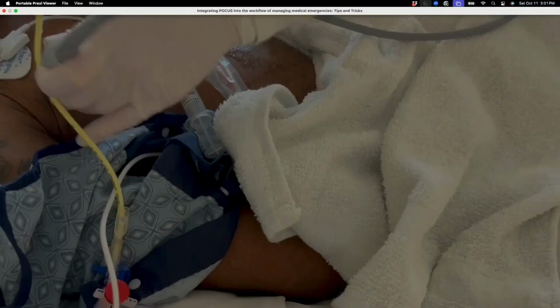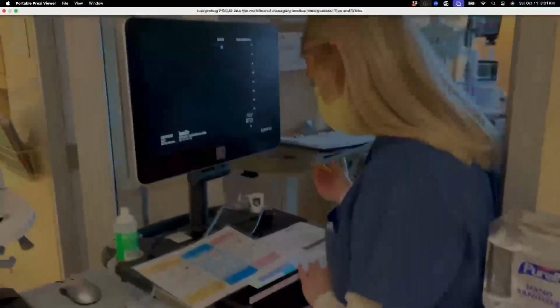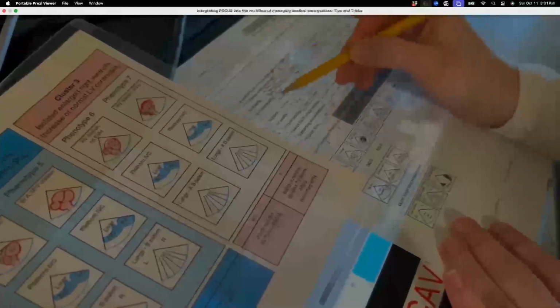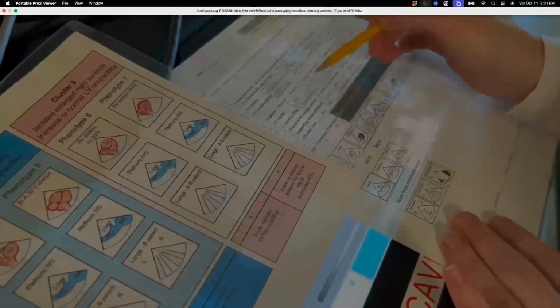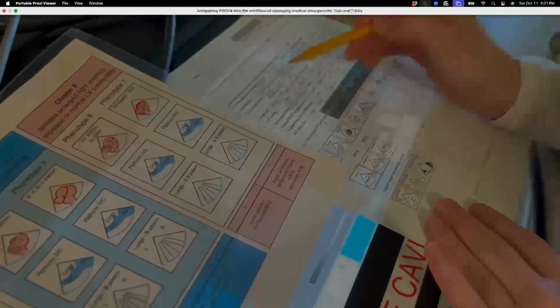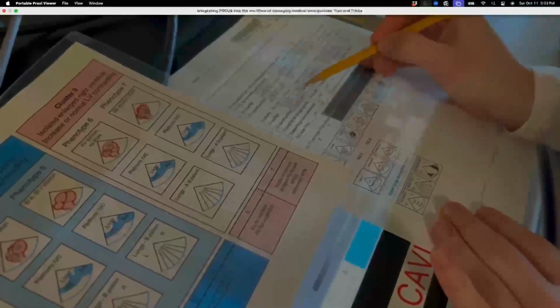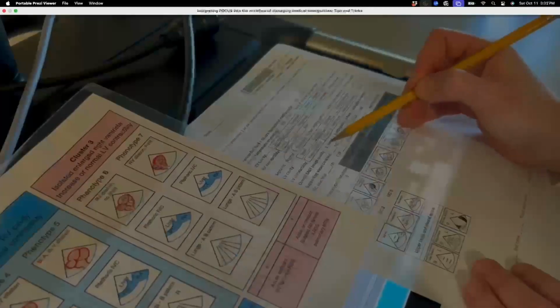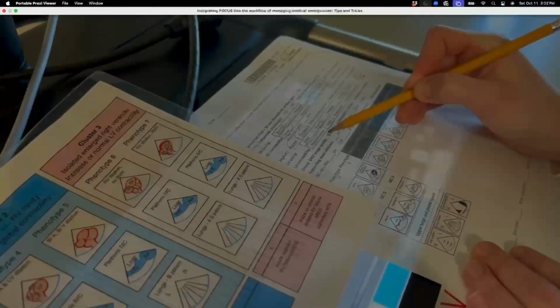After that, we go outside the room, we use the phenotype cards, and we assess the image quality together. Utilizing the phenotype cards, it was easier to start explaining all these differences of phenotypes to the residents. Normal in size, but there was hypertrophy, with very good image quality.